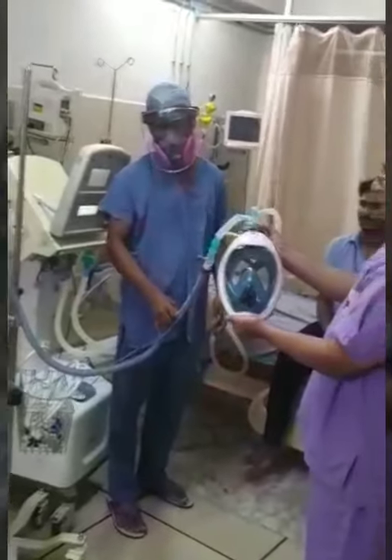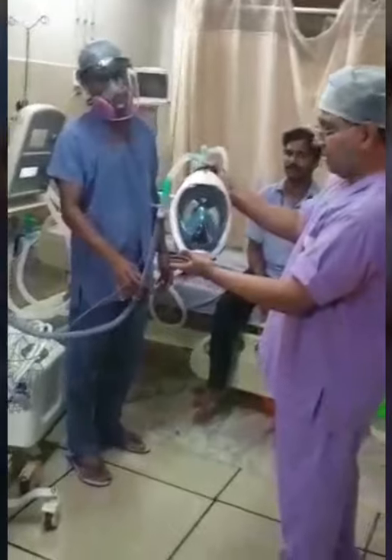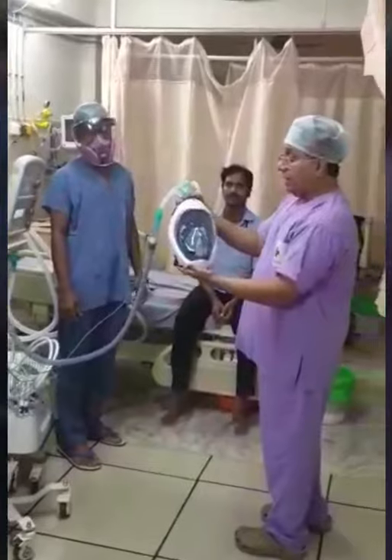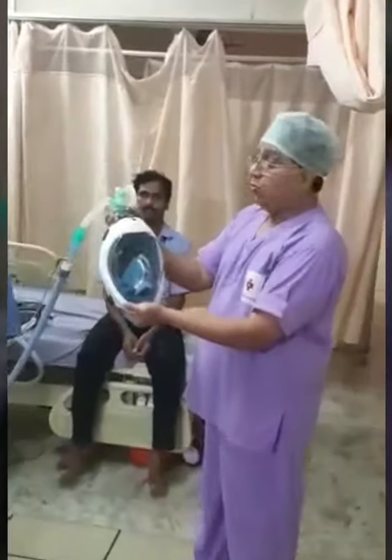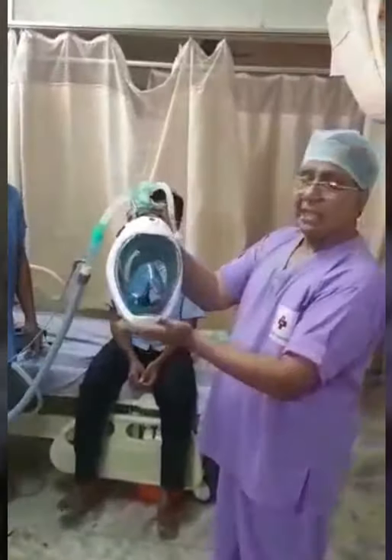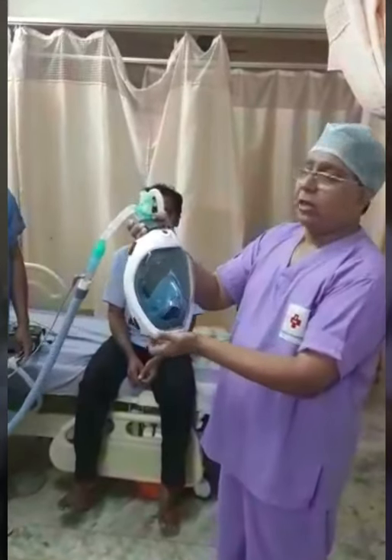The advantages with the snorkeling mask are: it is a better fit, patients are more comfortable, and the incidence of pressure sores that we see with ordinary masks routinely used for NIV is reduced using a snorkeling mask. These masks are available in India in plenty. This one I have sourced from Decathlon. Thank you.